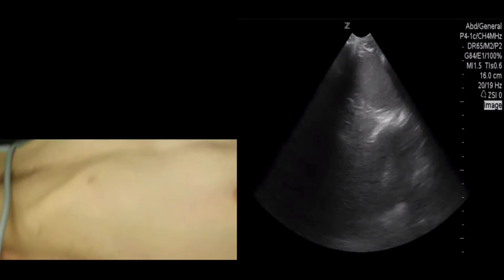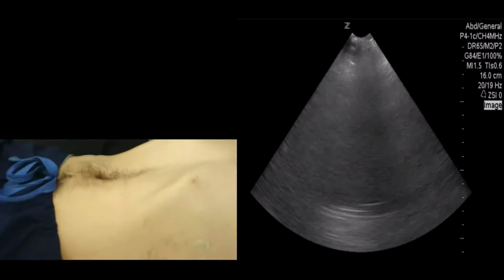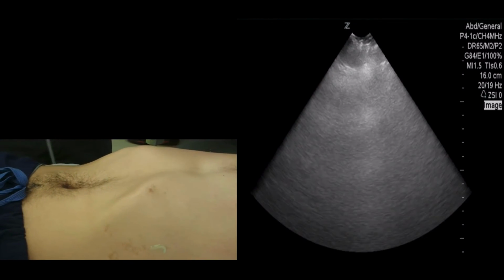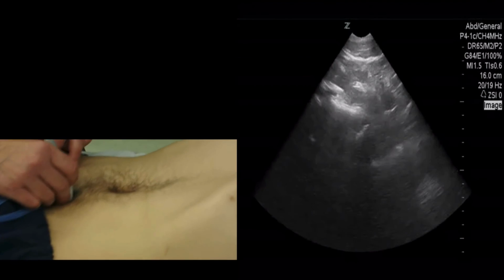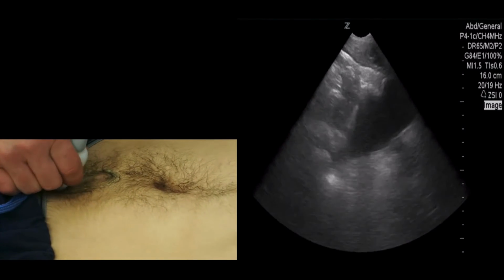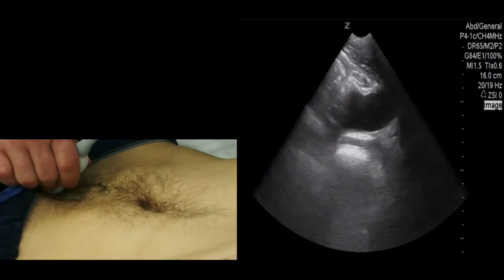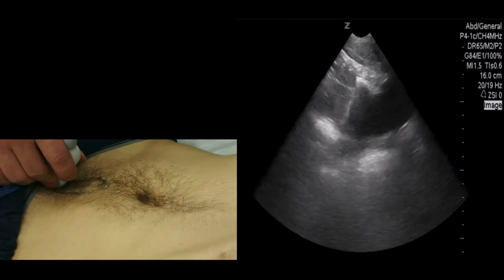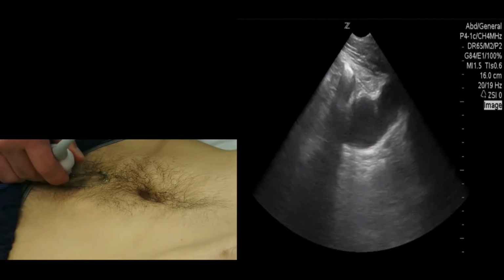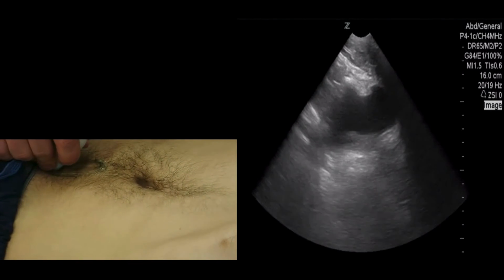After both kidneys have been interrogated, we should look at the bladder as well. We place the probe just above the symphysis pubis and point the ultrasound down into the pelvis. And here we identified the bladder. When evaluating the bladder, you want to note if it's decompressed or distended, if there's any obvious mass or clot, and if there's any hydroureter or stones. These typically come in right posterior in the patient. And also you can note if there's any free fluid below the bladder.